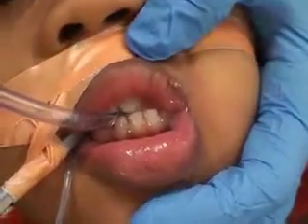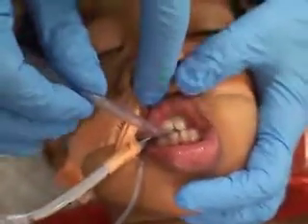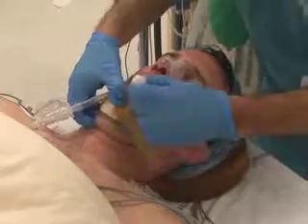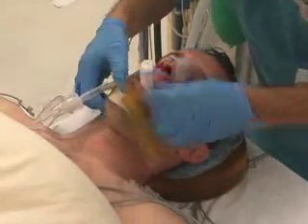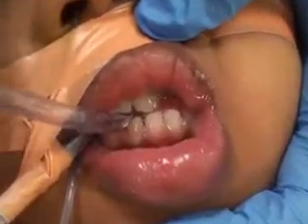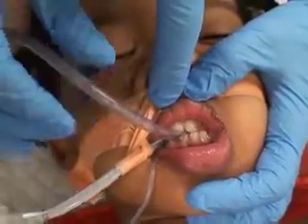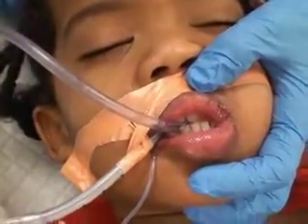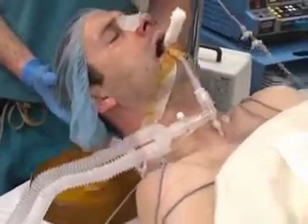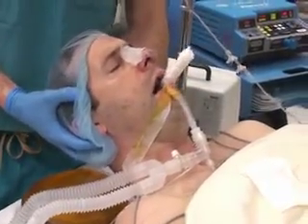To minimize the risk that the patient will bite the endotracheal tube, which could cause occlusion of the tube or result in dental injury, a bite block or an oral airway can be used. If the endotracheal tube becomes acutely occluded, negative pressure pulmonary edema may develop, in which case the extubation would need to be postponed. Patients emerging from general anesthesia often make forceful, uncoordinated movements just before they are ready for extubation.